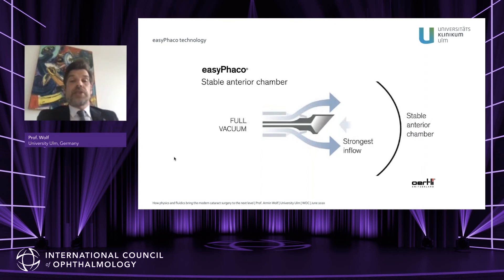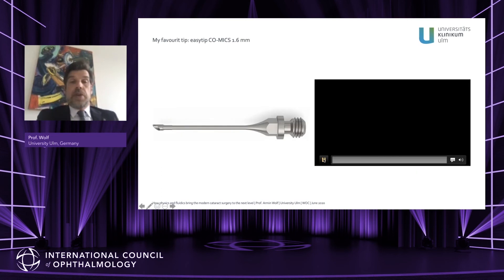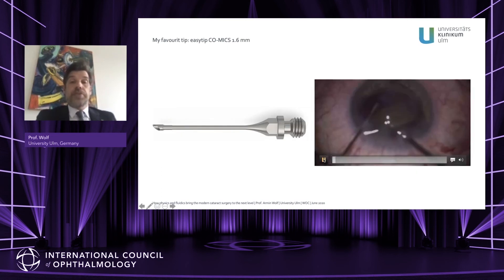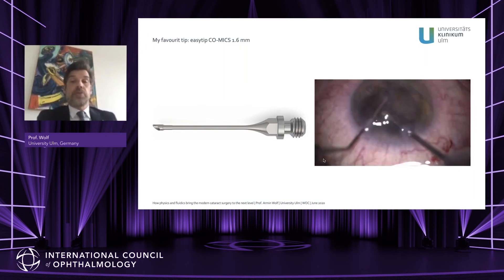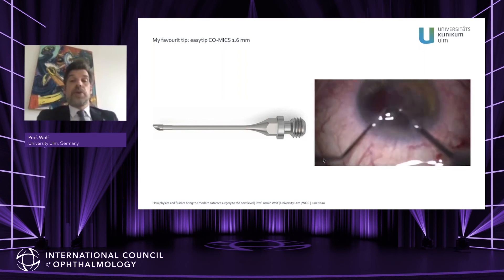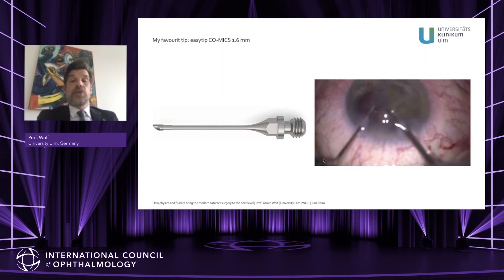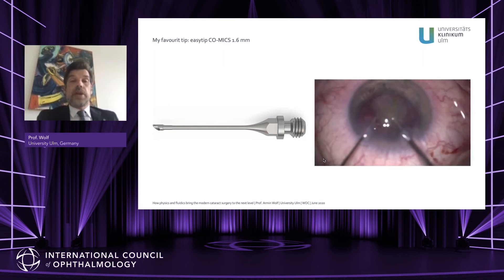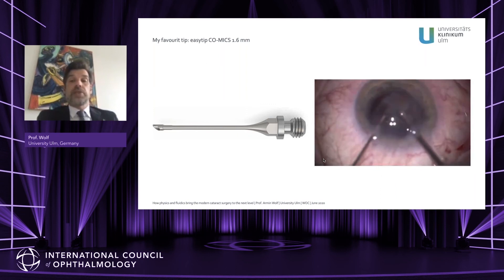The inflow into the anterior chamber is very controlled and gives you a stable anterior chamber throughout all your procedures. My favorite tip using easy FACO — which comes in different sizes, 2.2 as well as 1.6 — is the 1.6 tip. That allows you to perform cataract surgery using the speed mode with a strong holdability, as you can see in this video, with strong efficiency even in traumatized eyes.